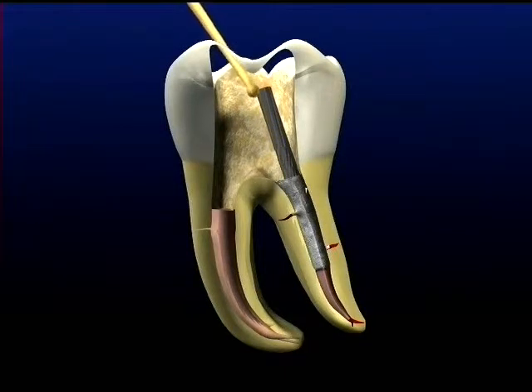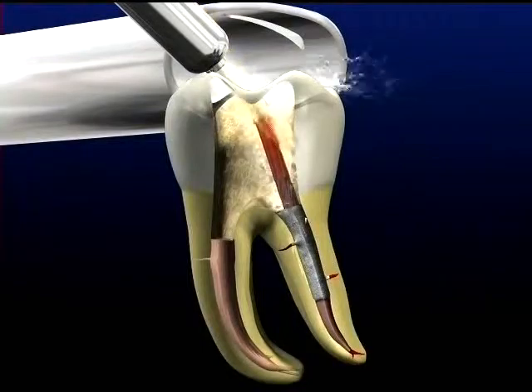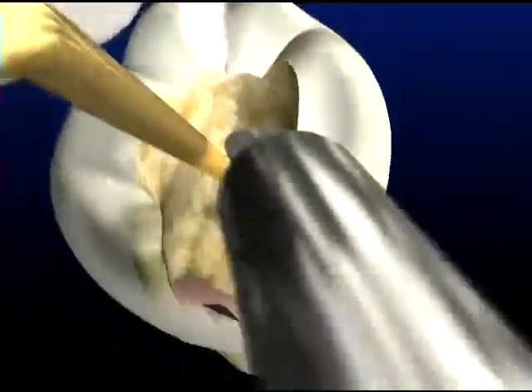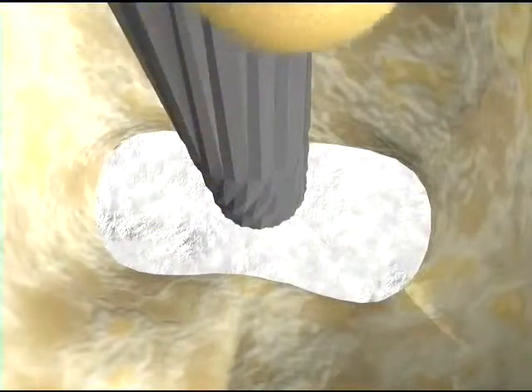The key is to rotate the instrument counterclockwise around the post. The vibration will have a tendency to heat up the post. Intermittent use of a water spray will cool the area and prolong the life of the ultrasonic tip. The vibration loosens the cement and the counterclockwise motion helps to unscrew threaded posts.